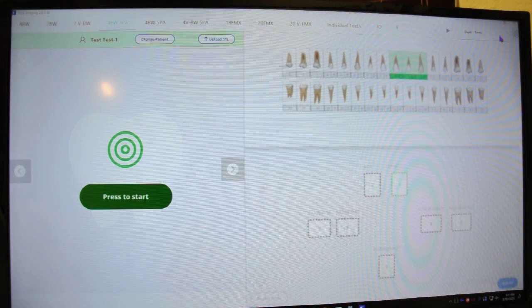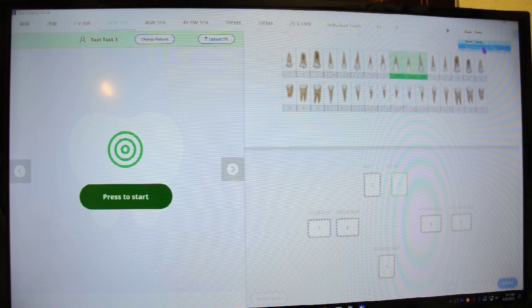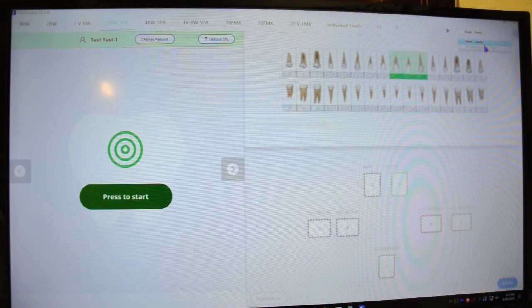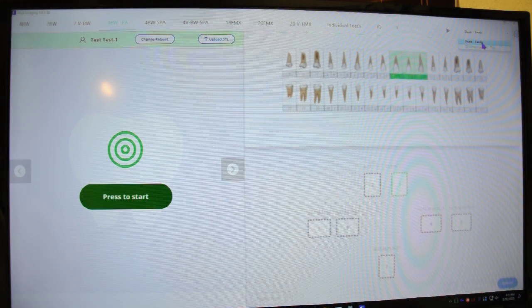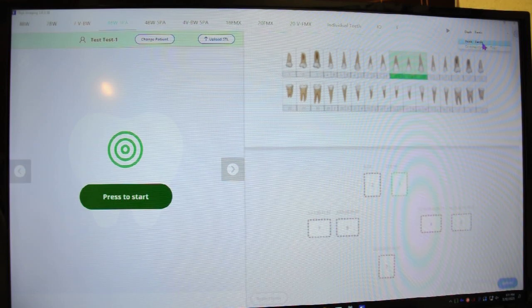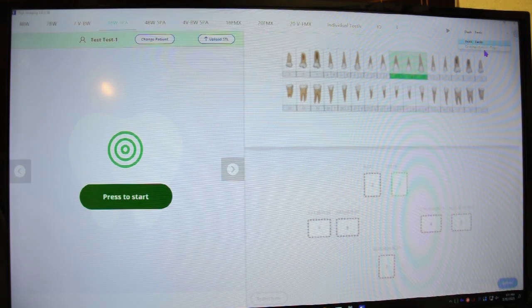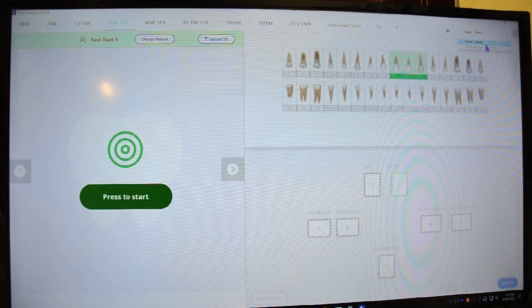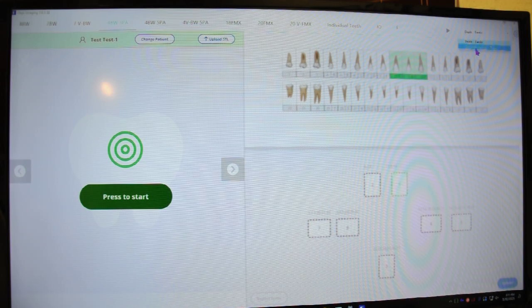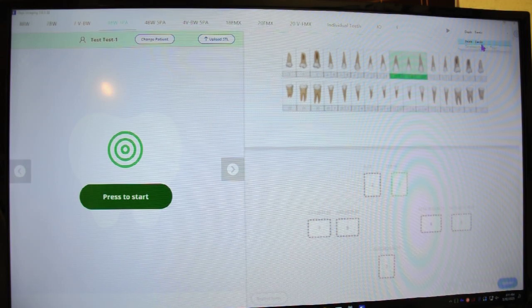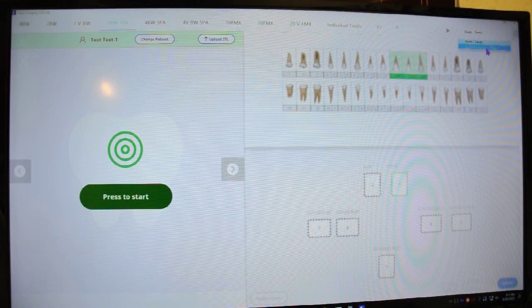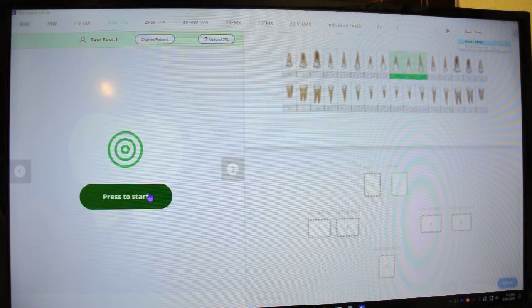The most important thing is that we have two sensors in our office. We have the DEXIS sensor and the Dentimax. I'm going to try and make sure that each room is set by default to the sensor that's in that room. But if you have any issue, one troubleshooting thing to look for is making sure that you have the right sensor selected before you start your X-ray series.